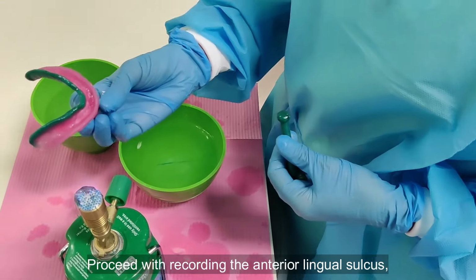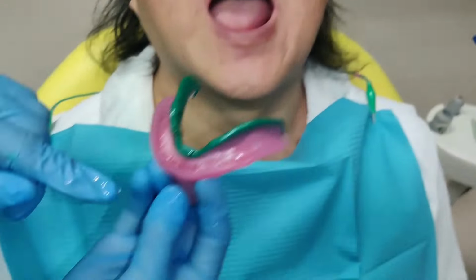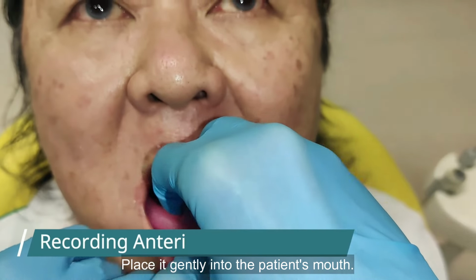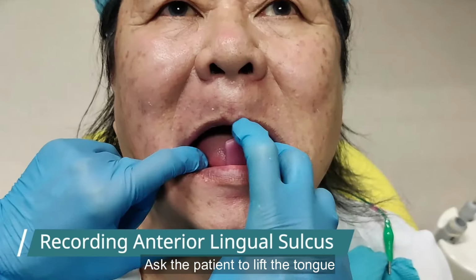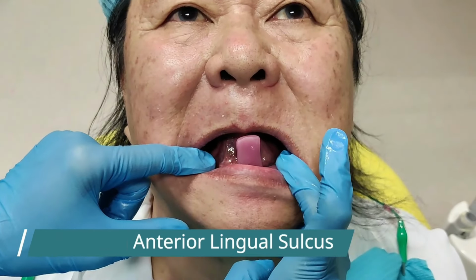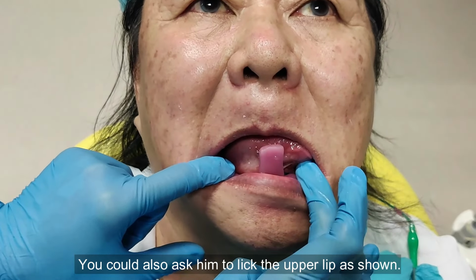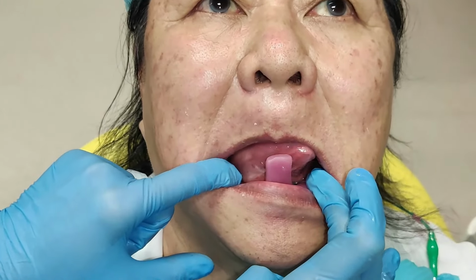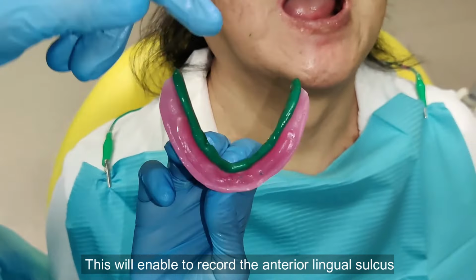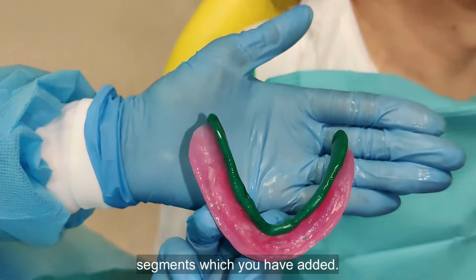Proceed with recording the anterior lingual sulcus by adding the material, tempering it and taking into the patient's mouth. Place it gently into the patient's mouth. Ask the patient to lift the tongue and touch to the anterior portion of the palate. You could also ask him to lick the upper lip as shown. This will enable to record the anterior lingual sulcus and ensure that there is a continuity between the segments which you have added.